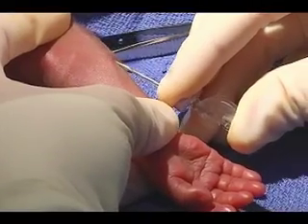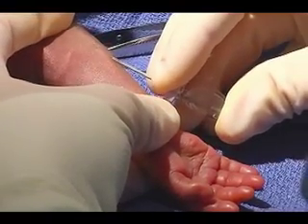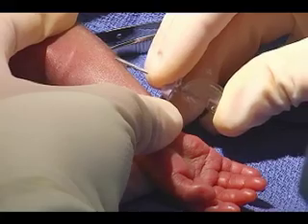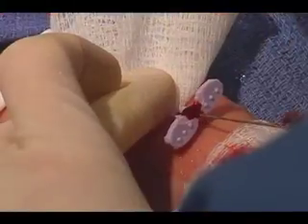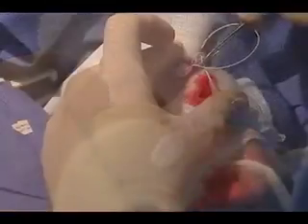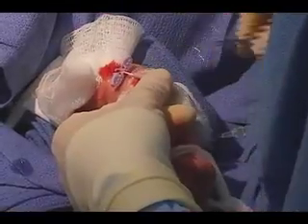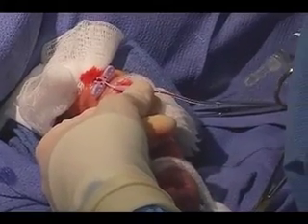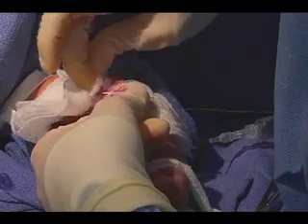And now illustrated on the patient. Puncture the vein with the introducer needle. Observe for blood return and remove the needle from the introducer. Slowly advance the catheter. When the catheter is properly located in the inferior vena cava or superior vena cava, blood should return with ease.